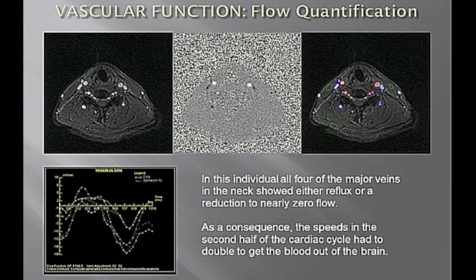So we cardiac gate this. We can't actually collect it in one rapid acquisition like CT does. So instead, if we have to take the picture 128 times, we gate to the heart 128 times. But each time we do that, we have the potential to collect a resolution of 0.5 millimeter by 0.5 millimeter in plane. So as long as that heartbeat is regular, consistent, periodic, then every time I make that measurement and integrate things together to create that 2D picture, I will have a fairly consistent result.